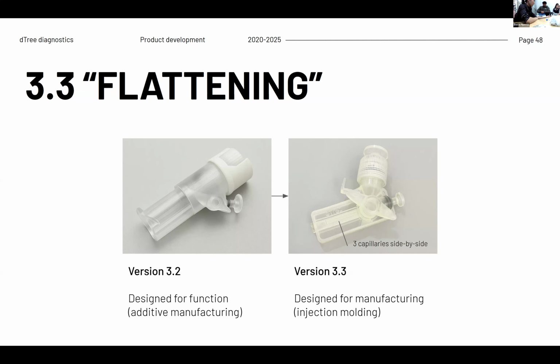Anyway, there's a lot of different exploration, but feel free to look through it. At one point, the very first time we flattened it, you can see that the walls are much thinner, and I didn't realize you can easily break that in half if you're trying to turn this valve. So that's when we introduced the higher lip so that it can be more structurally stable. But feel free to look through any of this.